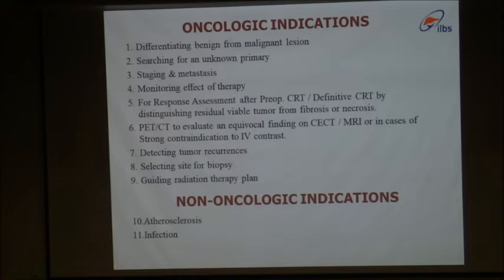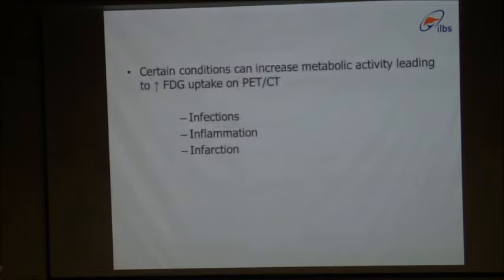Non-oncological indications are atherosclerosis and infection. Certain conditions can increase the metabolic uptake, leading to increased FDG uptake on PET-CT. They are infection, inflammation, and infarction.